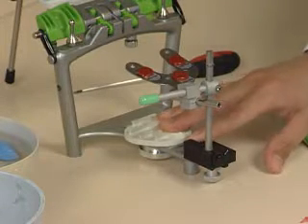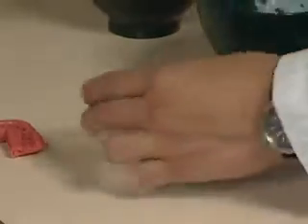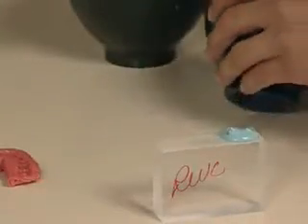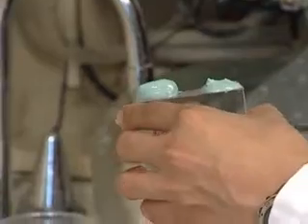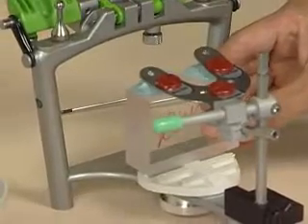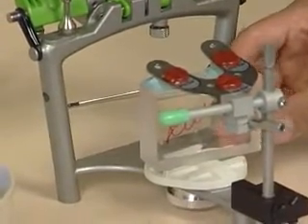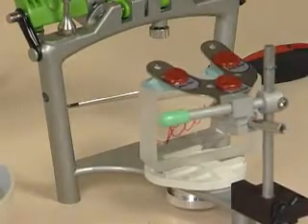Okay. Now the next thing is that you want to support the bite fork. You don't want to put a model on. The weight of the model will tend to dislodge the bite fork. And so you want to support it. So we're going to mix up some quick set stone and put a couple of little dabs here and slip it underneath like this and let it set. That will support the bite fork.